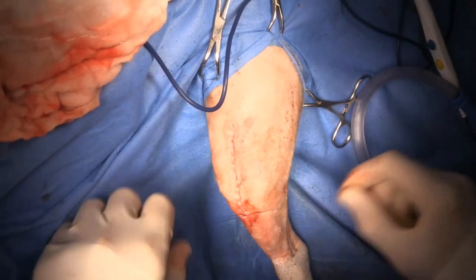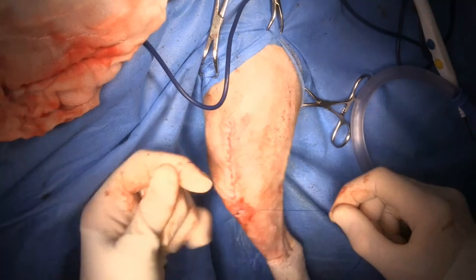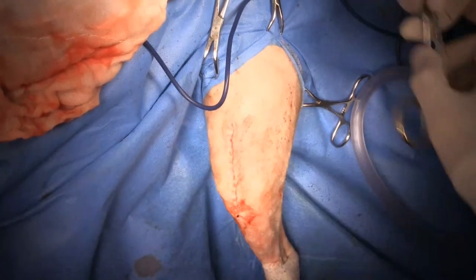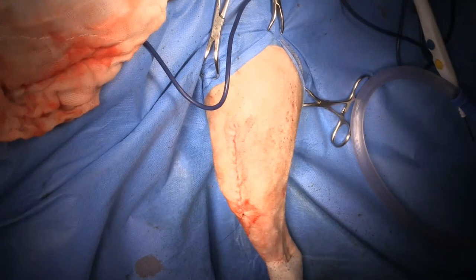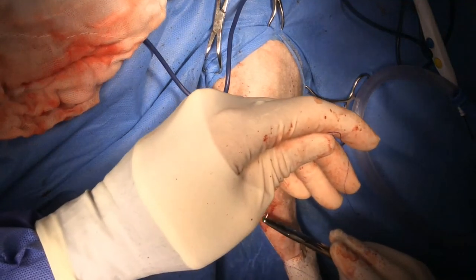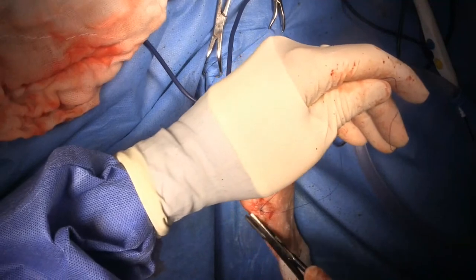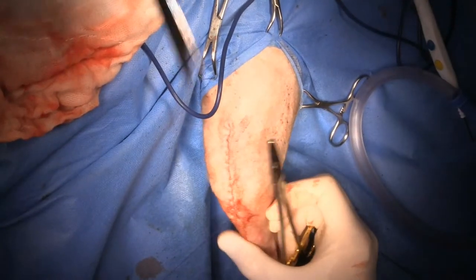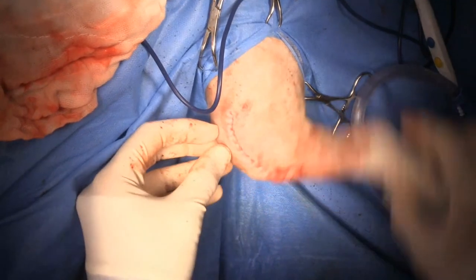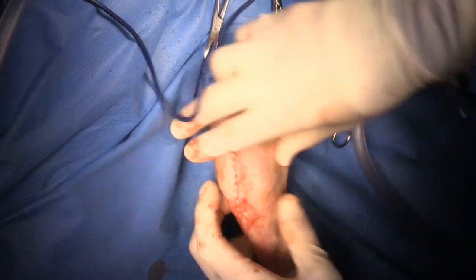Just before we finish up, I'm going to run it through range of motion to make sure I'm happy that the patella is firmly in place. Range of motion is great, there's no restriction, and I cannot luxate that patella. Excellent.